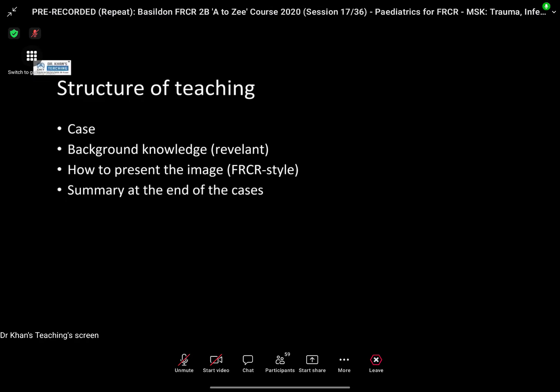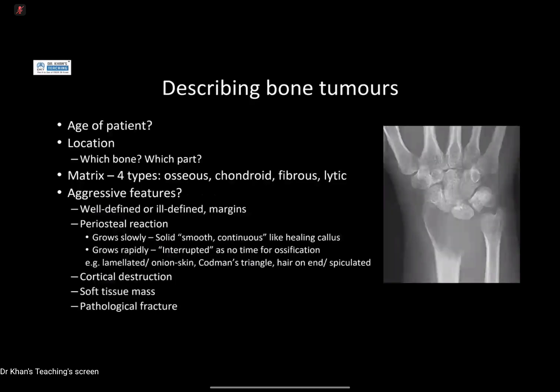And we'll also talk a little bit about how to present the images and how to present them for exam purposes. And there'll be a nice summary at the end of each case. So for me, I think having some sort of framework is really helpful. And there are always clues in the image.